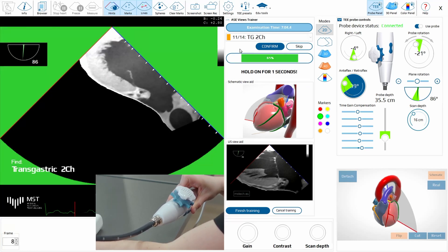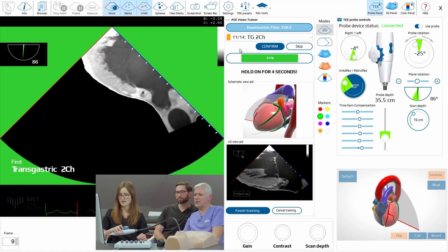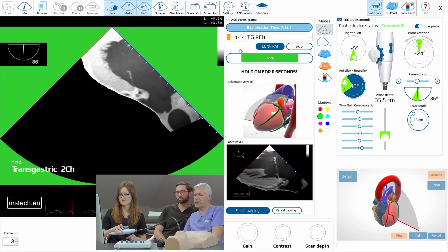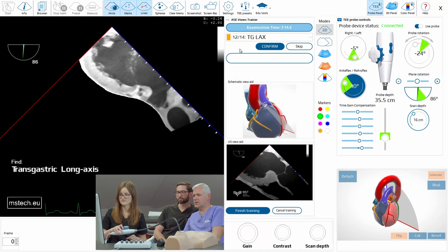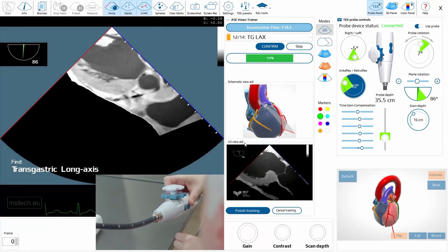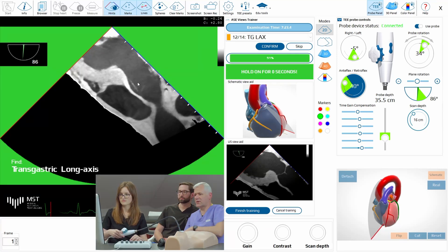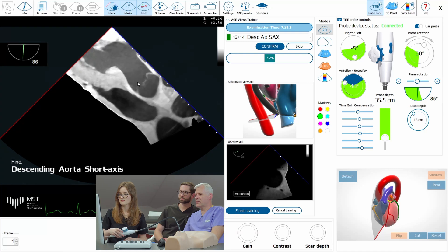Maybe not perfect, but it's almost there. And finally the long axis — you keep it when it's green. And now long axis, so you have to move to see the aorta. Yes, and slightly correct the angle. Perfect. Good.